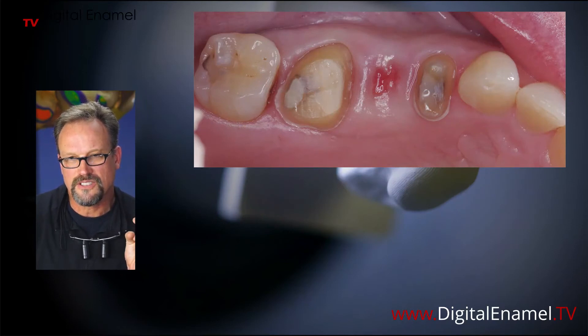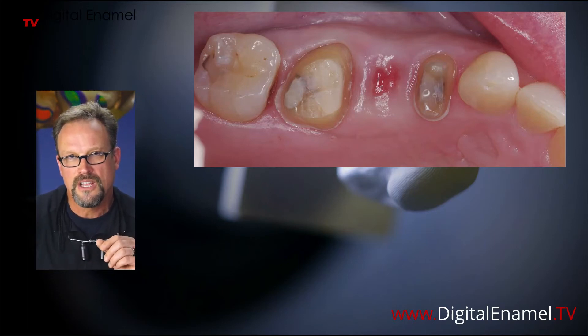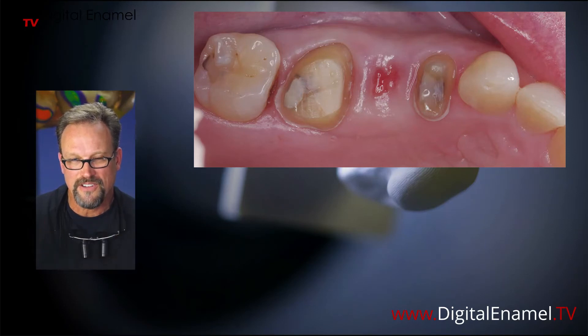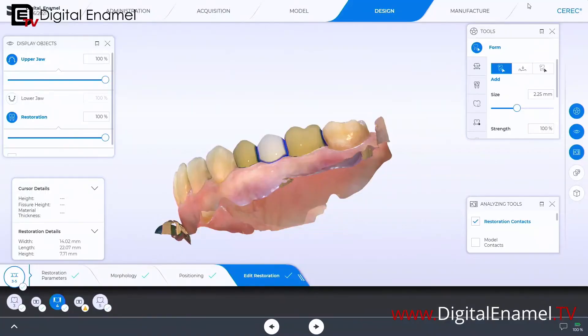I'll show you the buccal shot as well. We made a temporary to shape some of the tissue. You don't have to shape it a hundred percent with the temporary — in fact it may be advantageous for the tissue to not be totally mature. This is probably about 99% of the way there, because in the software when the tissue is a little softer you can put some pressure into it. When you're seating it you want just a faint little blanching, and that will keep food debris from getting up underneath the pontic.